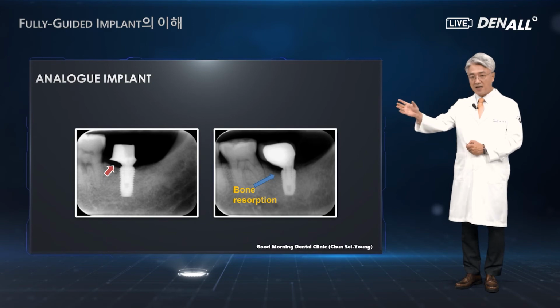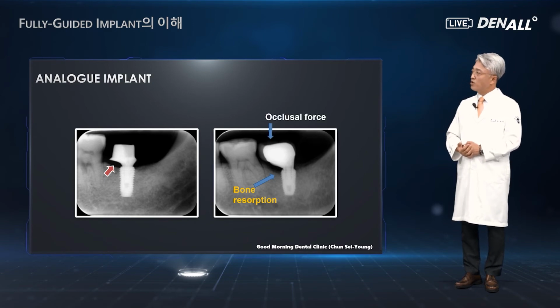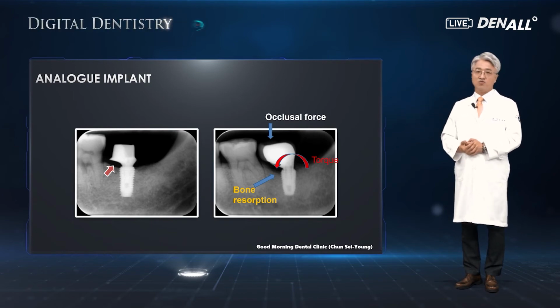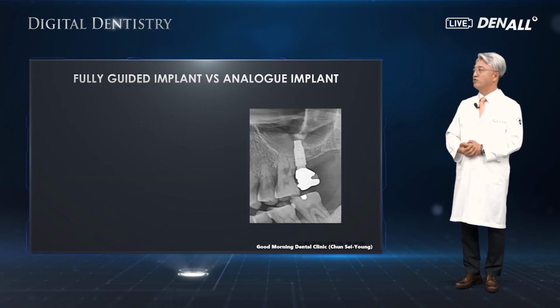This is inevitable because the fixture position is a little bit distal and the occlusal force is applied anterior to the fixture. Therefore, the torque is applied to the connection part.